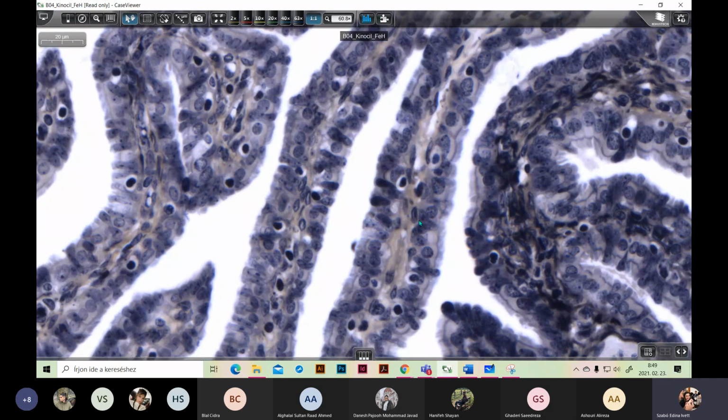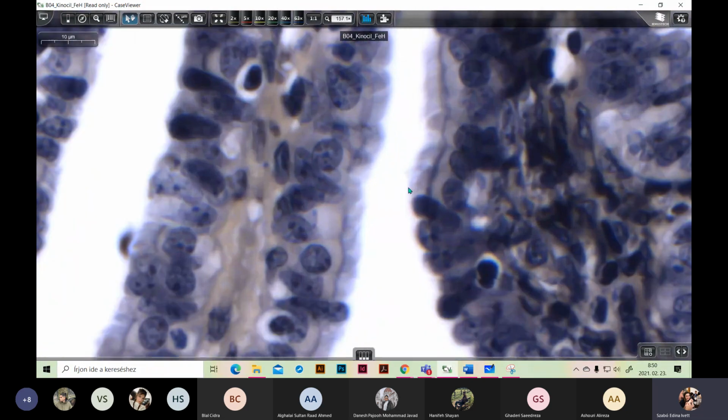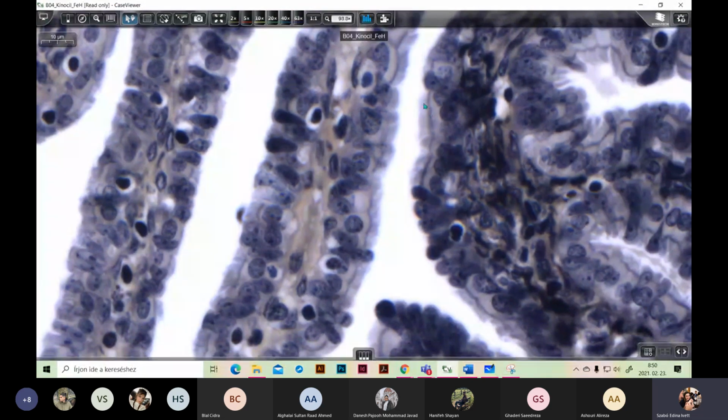Very good. Thank you. And what is this line? Basal body. Line of basal bodies. What is the function of the line of basal bodies? The body of the kinocilia is placed inside. It fixes the kinocilia on the surface of columnar cells. And what is the surface modification?